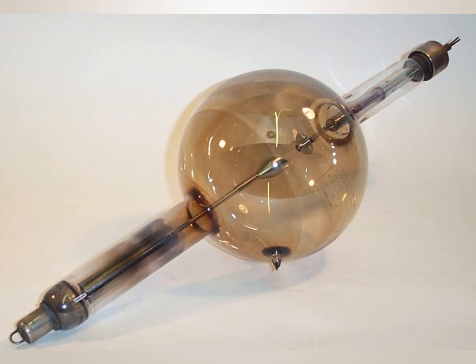While modern X-ray tubes are heavier and somewhat more complex, they are not significantly different from the Coolidge hot cathode tube. Probably the biggest difference is that most medical X-ray tubes today have a rotating anode, which allows for very high mA and short time exposures. Currently, stationary anode X-ray tubes are relegated to low power applications such as dental radiography. I will cover the innovation of the rotating anode in a separate presentation.